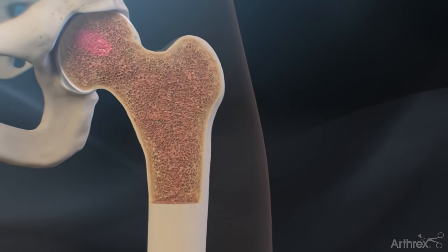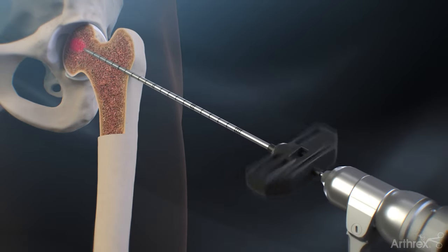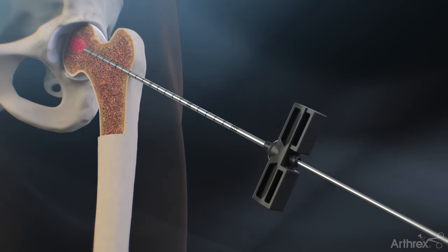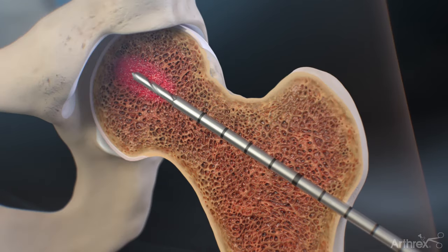For a femoral head lesion, advance the delivery cannula according to the MRI using fluoroscopic guidance to ensure the cannula is positioned appropriately into the subchondral bone. Remove the inner stylet, then advance the 3.3 mm guide pin to the desired decompression depth.